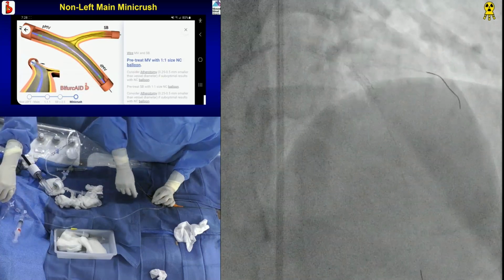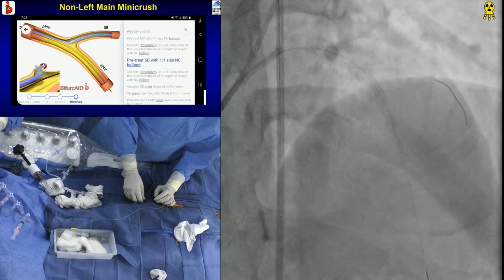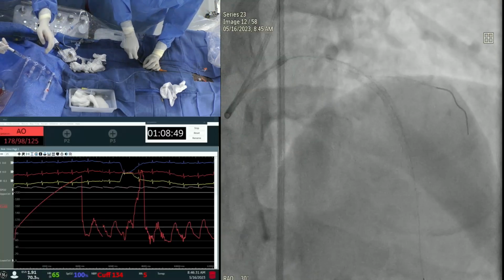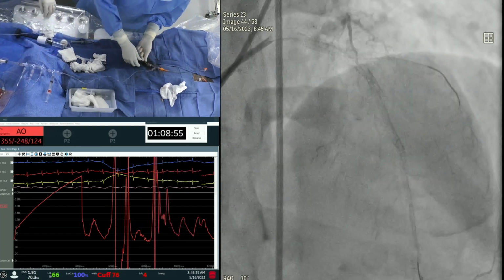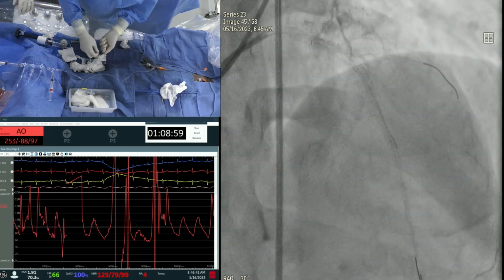I'm going to take the diag wire out. No, but let's take a picture and then take out, in case there is a dissection display, which is not. No. Good. Very good. All right. Let's go with the fantastic results so far. Require little makeup now. The main thing has been done. So do you want to see IVUS live? Yeah. Okay. Let's go to the presentation now.